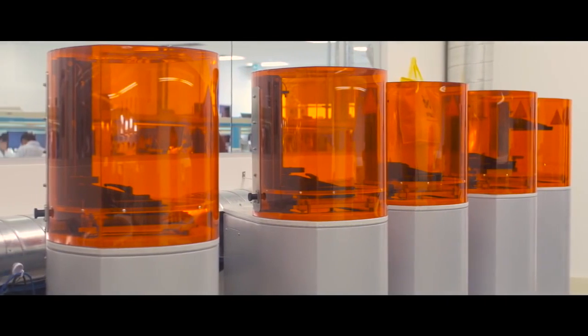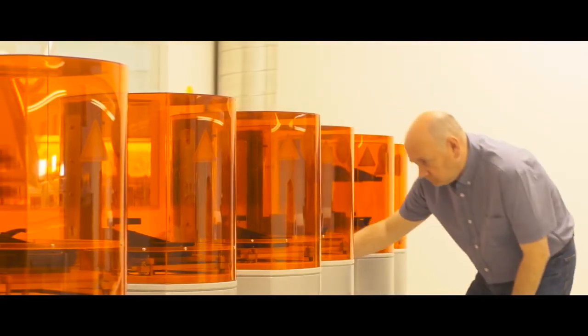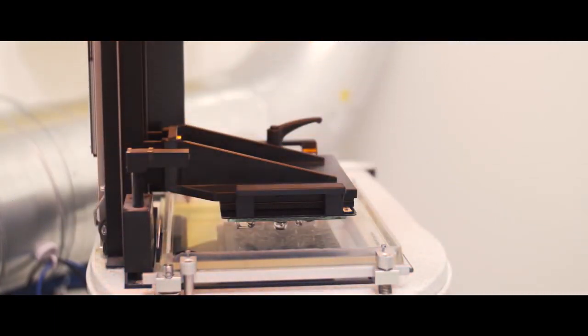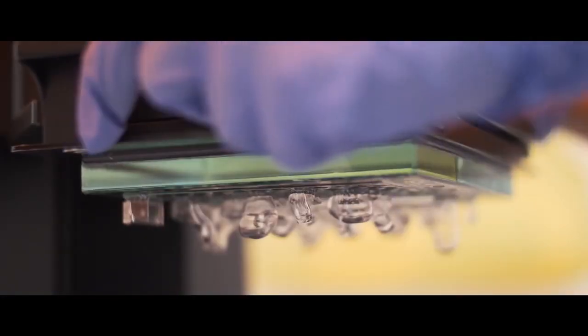My name is Samantha, and I've been with the company for over 3.5 years. After RSM, the shells will go to digital shell manufacturing. We will use our Envision Tech 3D printers to then print the shell as to what RSM had modeled. It will use a liquid acrylic base, and it will spray layer by layer with small bursts of UV light to cure the shell and build it up from nothing. The process is called digital light processing. Our 3D printers are capable of printing close to 40 shells in an hour, which greatly reduces our internal turnaround time.